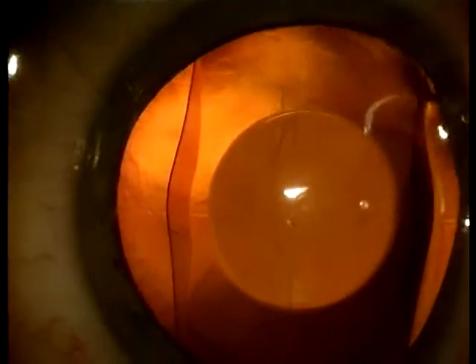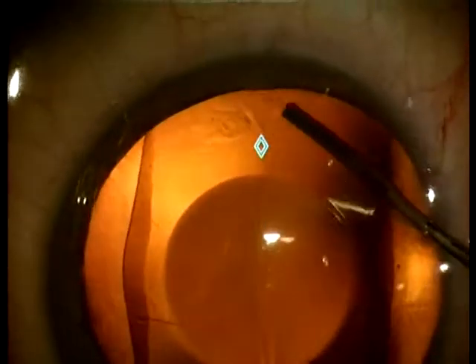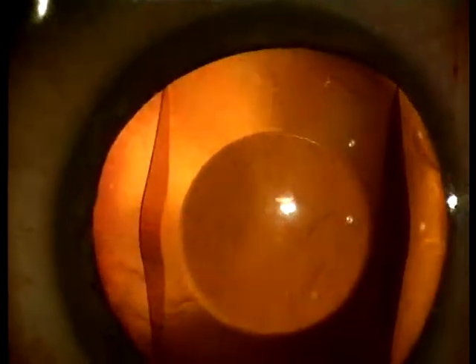At the end of surgery the diamond shaped markings on the toric ICL are aligned with the epithelial indentations which indicate the horizontal axis. In this way the astigmatic correction in the optic part of the lens is aligned with the cylindrical error of the eye.